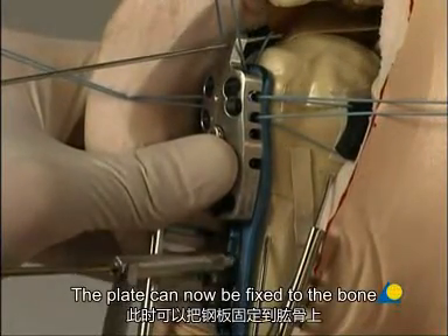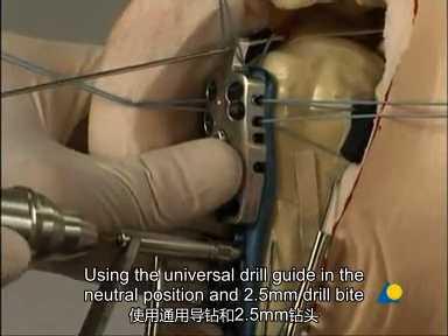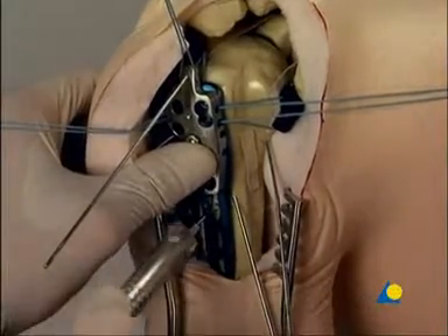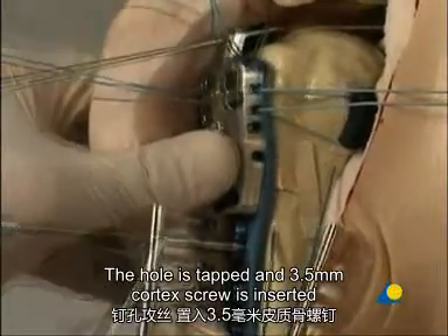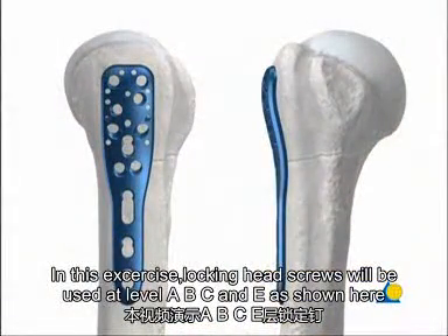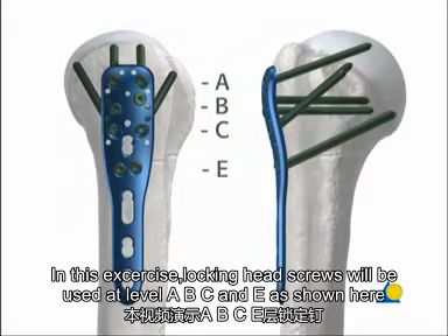The plate can now be fixed to the bone. Both cortices are drilled through the dynamic part of the long hole, using the universal drill guide in the neutral position and the 2.5 mm drill bit. The screw length is determined with the depth gauge. The hole is tapped, and a 3.5 mm cortex screw is inserted. In this exercise, locking head screws will be used at levels A, B, C, and E.